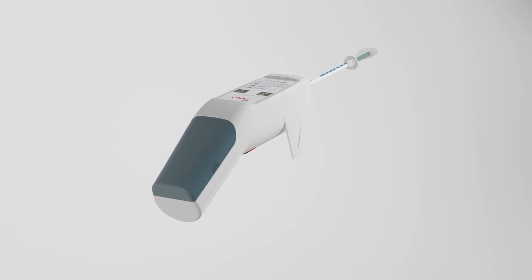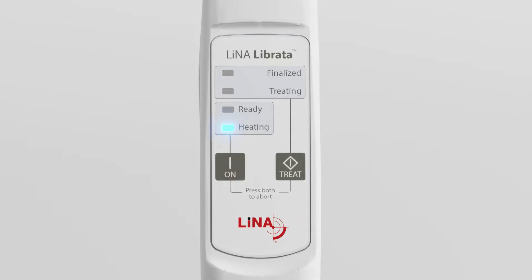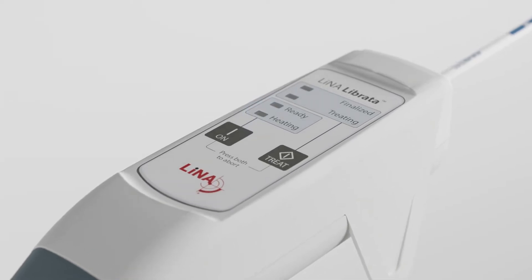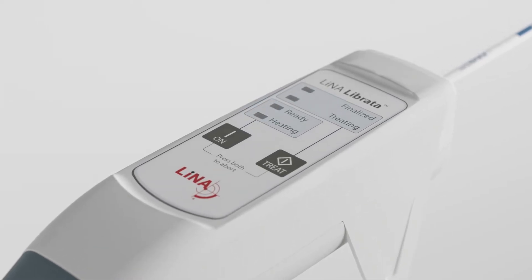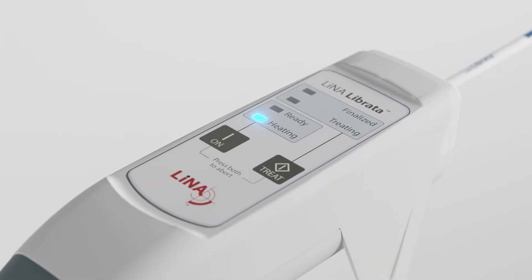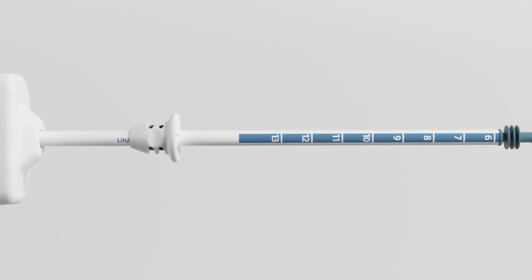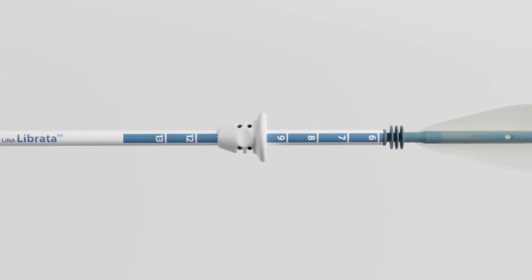Simply insert the battery and press the on button to initiate the preheating process. As the device preheats, you will complete a simple sounding of the uterus from the external os to the fundus. The sounding measurement will then be used to set the indicator ring on the catheter shaft.